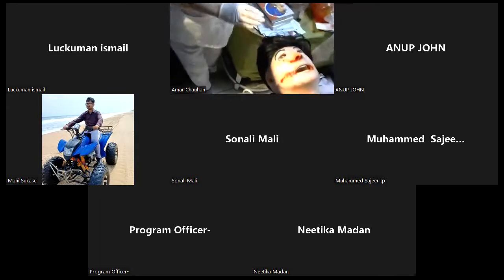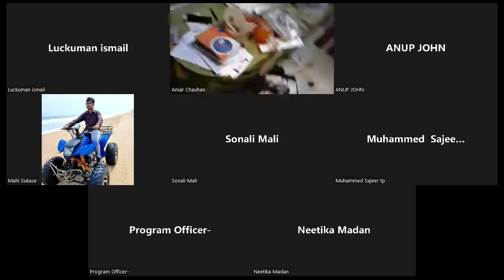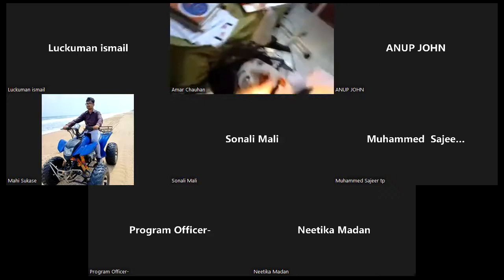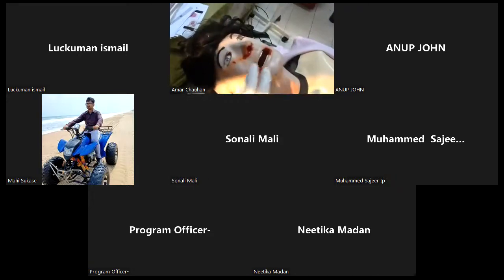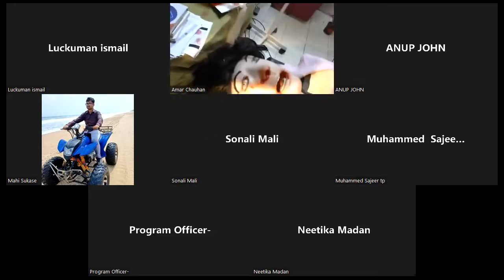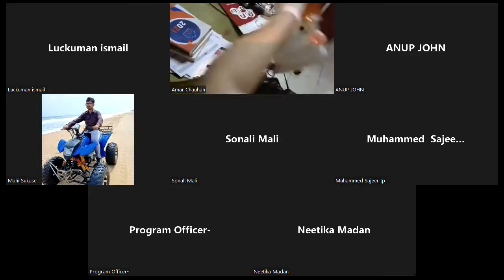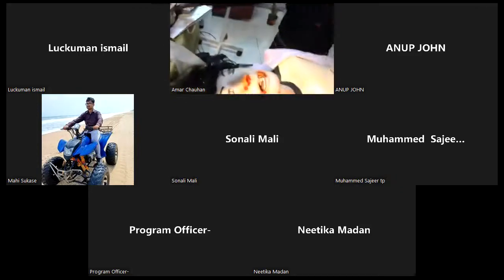Now his breathing has cleared, and this is an audio cue also that you can know your jaw thrust is effective. So after I do the jaw thrust, his breathing has returned to normal. So this is demonstrating the airway, and simultaneously you can apply a cervical collar. You can do BVM. So this was A. I will go by the ABCD protocol.